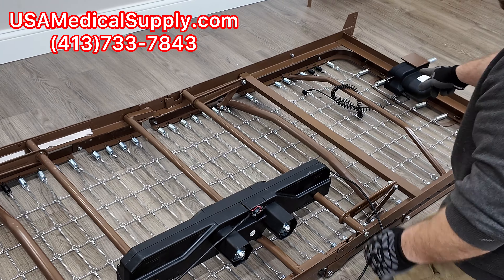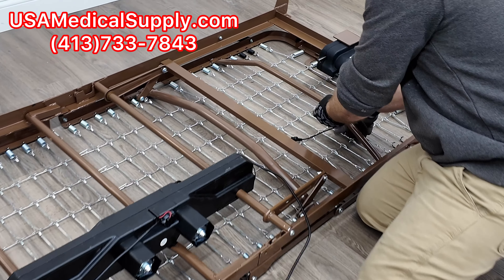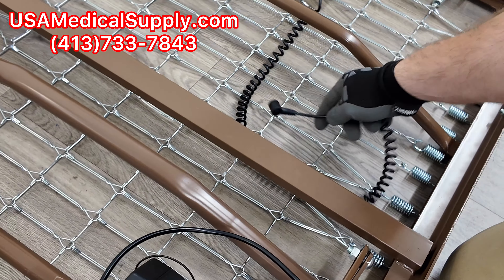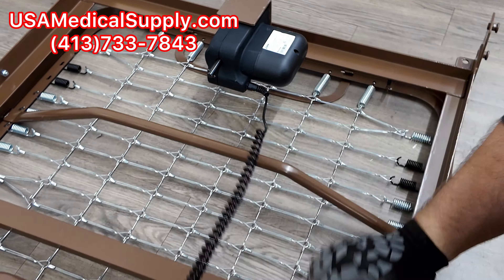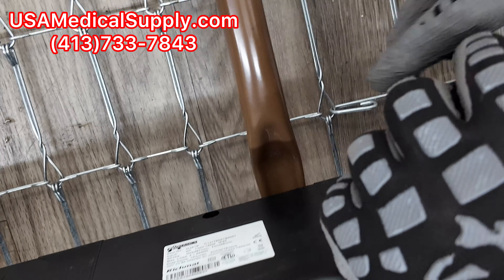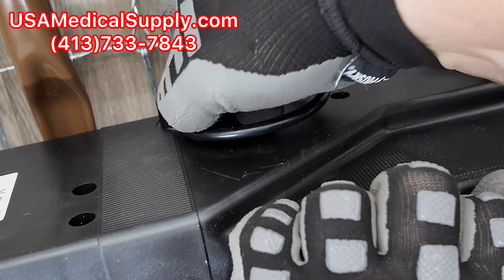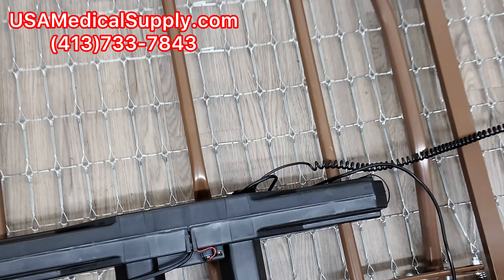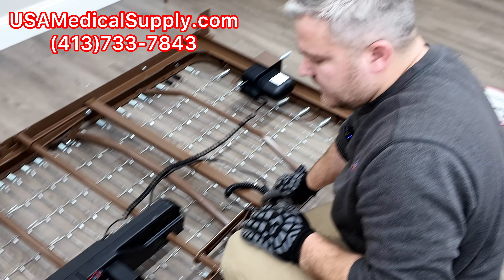Now plug in the second motor — the one that raises and lowers the entire bed. Route the wire so it's not caught in the sections that will go up and down; just make sure it's loose. That second slot next to the remote port is where this plugs in, and again it can only be plugged in one way. Make sure it's fully in.